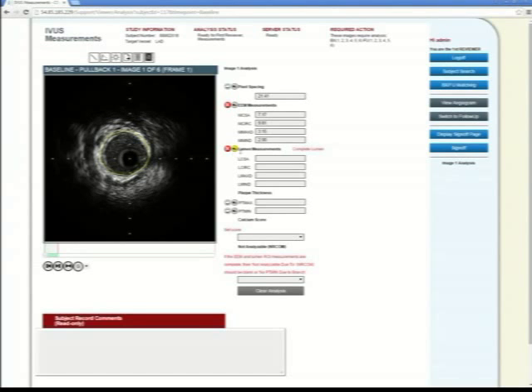And then the next step is to trace the luminal border, which is the inner border tissue, if you will, at this space. So now the cool part about this, I know this seems simple, but when you see people who do these measurements for trials on a regular basis, they make the measurements and they're writing stuff down. The fact that these numbers on the right are auto-populated based on the measurements is not only a good quality thing, but it's an efficiency thing, and there's all sorts of good that just happens behind the scenes. The analysts love this kind of thing. So this is really beautiful.